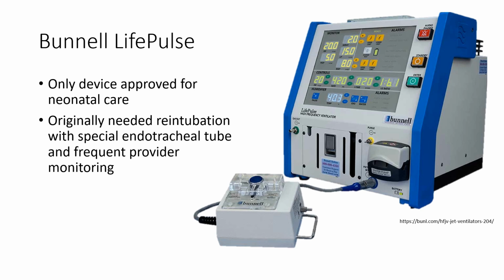quieter water pump. When the jet ventilator was initially available for use, utilization was limited because the patient had to be extubated and reintubated with a specialized endotracheal tube that allowed for the delivery of jet pulses. Also, the user would need to frequently monitor ventilator pressures and adjust servo pressures accordingly. These barriers were overcome with the creation of the LifePort, which would connect to the endotracheal tube, which provided a port for the delivery of jet pulses and monitoring of tracheal pressure and servo adjustments.